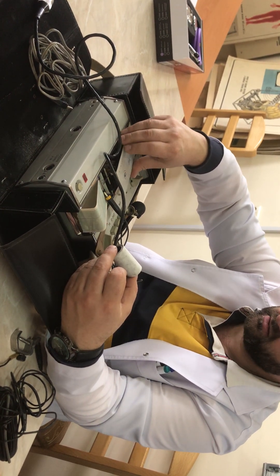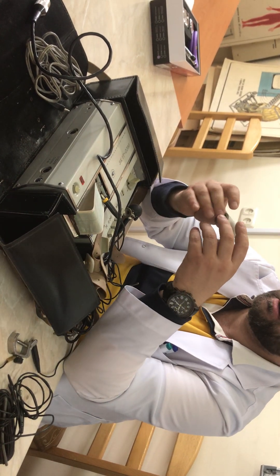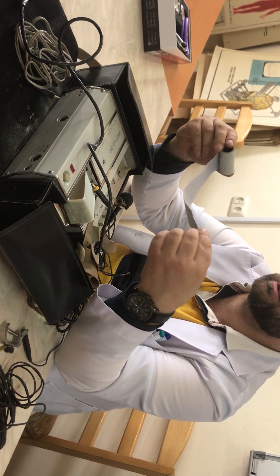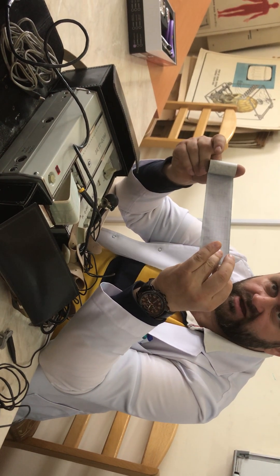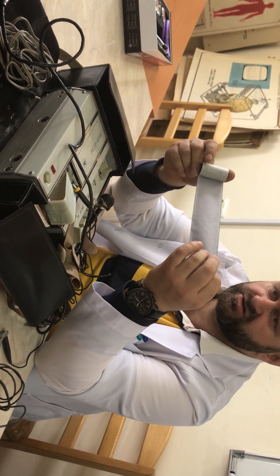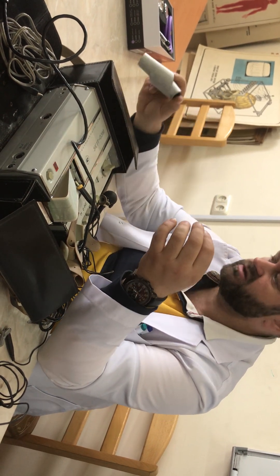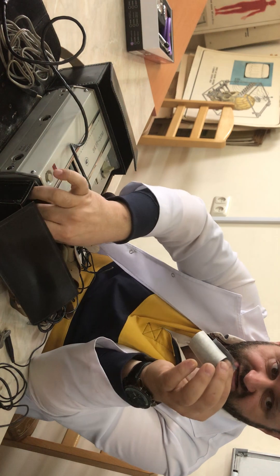Looking at the ECG registration on paper, we use a specific type of paper with specific gradation. Every small square is one millimeter, and the major divisions are every five millimeters. This gradation allows fast calculation of the ECG, which is most important for making specifications and realizing that registration.